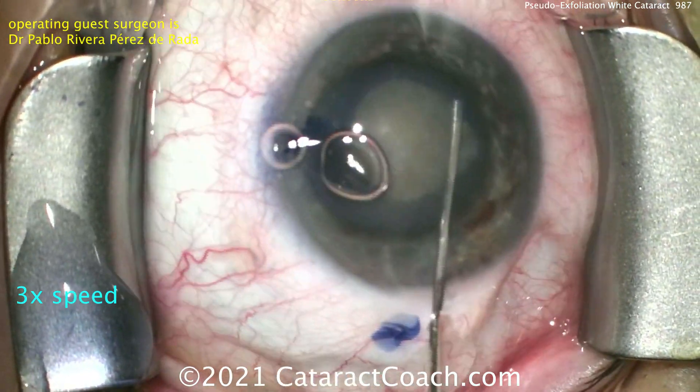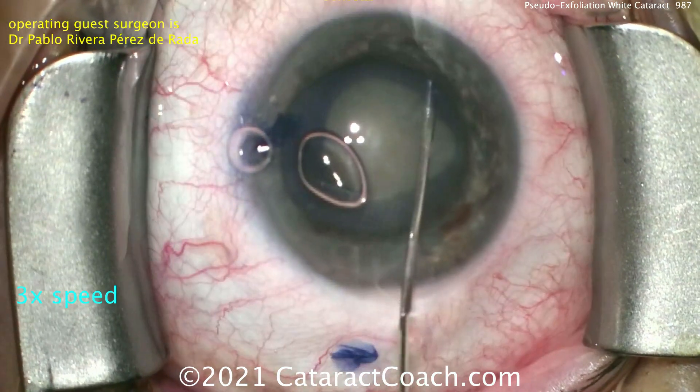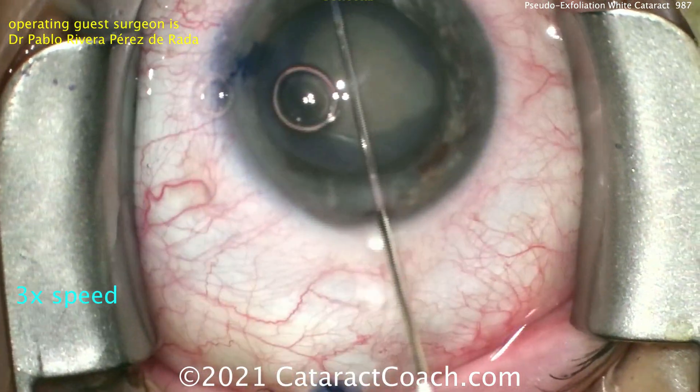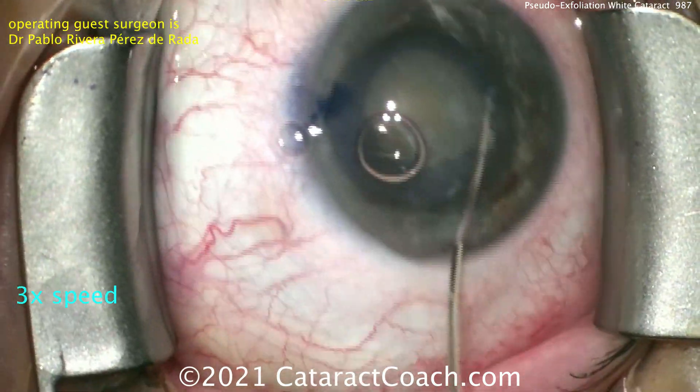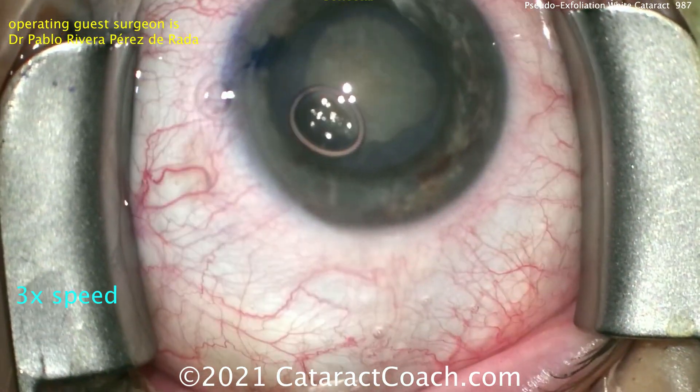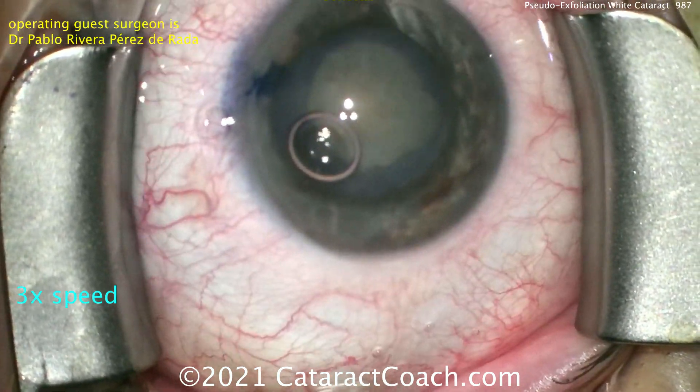A little viscoelastic to coat the epithelium, and here comes some balanced salt solution for hydrodissection. Now often in these white cataracts, you don't have to do too much hydrodissection if they have liquefied cortex or even softened cortex, so that looks pretty good.